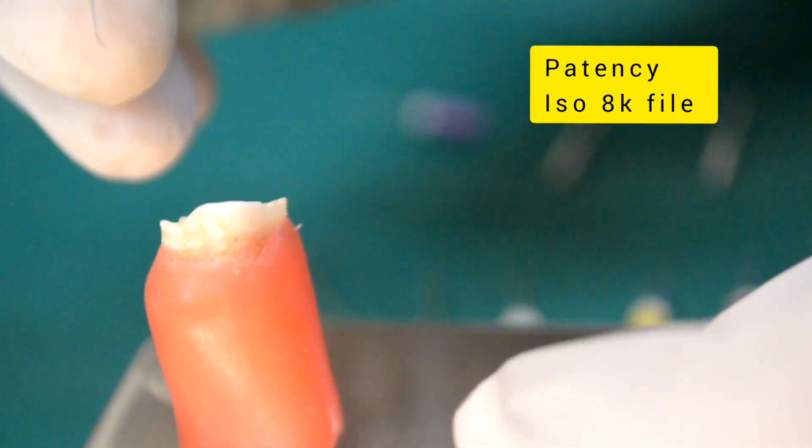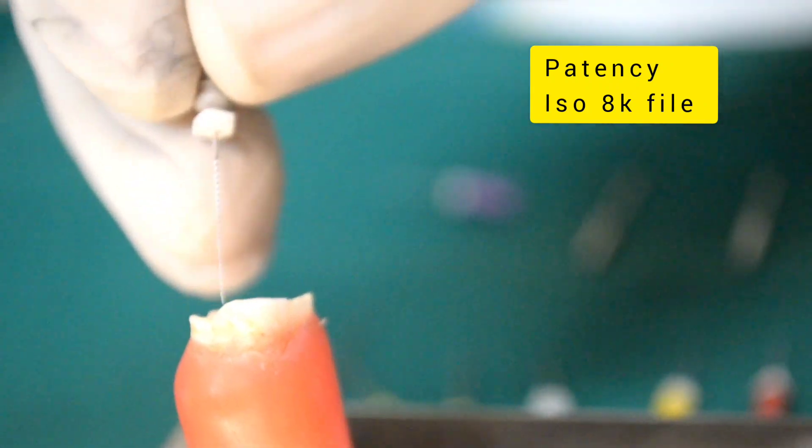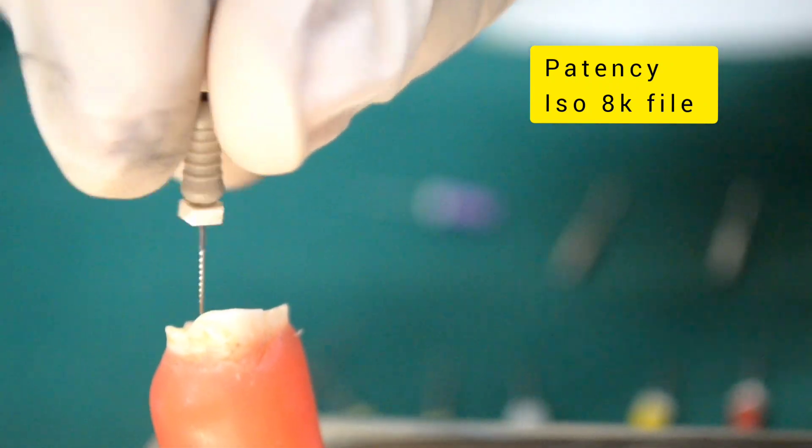Now let's look at it clinically. Patency of the canal is first established with a pre-curved number 8K file.